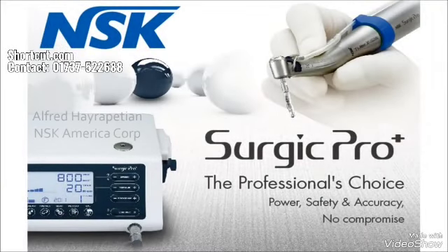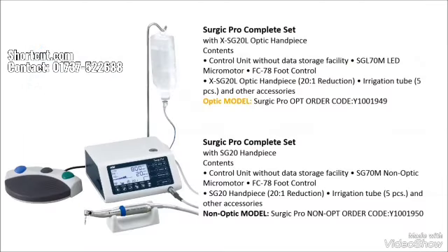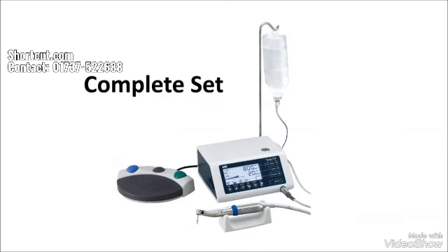Hi, my name is Alfred Hierapetyan and I'm the product manager of NSK America. Today I'm here to show you NSK's surgical micromotor called Surgic Pro. Surgic Pro comes in optic with LED light and non-optic models. We begin with explaining the contents of the package and a quick review of their functions. Then we'll set it up and go over the basic operation of the machine. At the end we'll touch on the maintenance and sterilization. Let's begin.